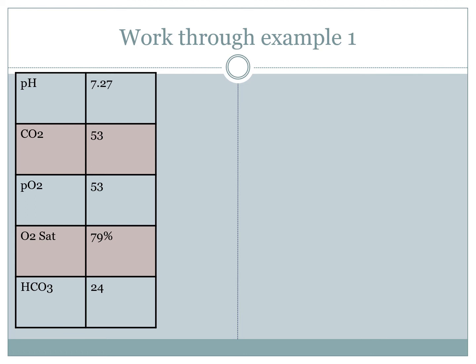So you'll see a nice easy printout in front of you, and what I want you to do is just notate whether it would be acidotic or alkalotic or normal values that you see in front of you. And essentially this is what you do when you get a blood gas. Even though most of the time you get a blood gas printout, there will be a lot of additional numbers, and that's where a lot of the confusion comes from.